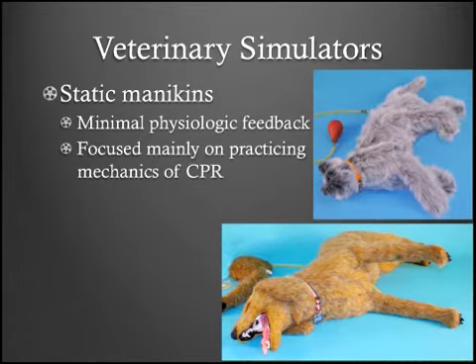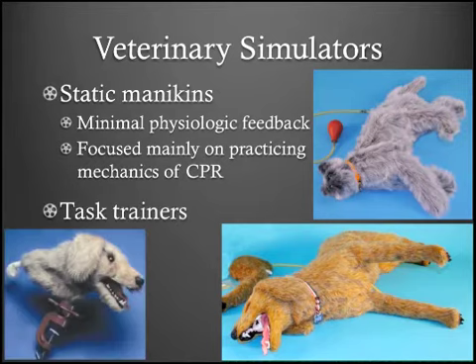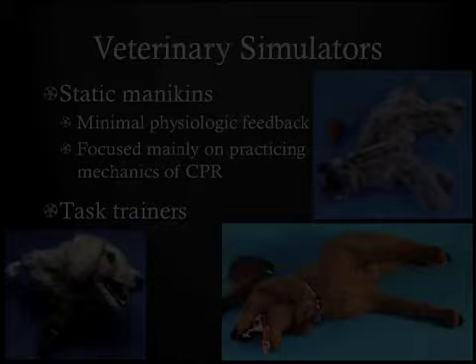Veterinary simulation products for immersive learning experiences have been limited to static mannequins that provide minimal physiologic feedback and that are focused mainly on practicing the mechanics of CPR, as well as to task trainers like intubation heads or catheterization models that allow skill development but not clinical decision making.